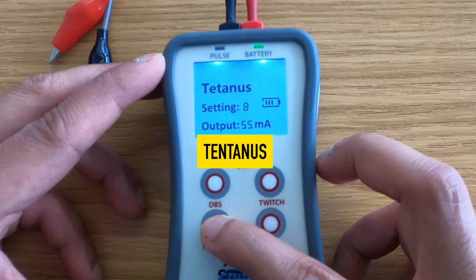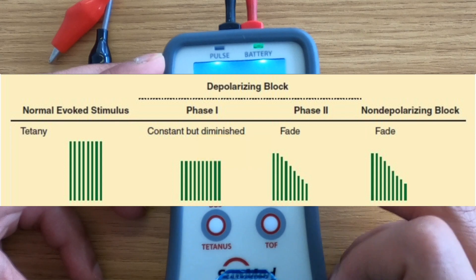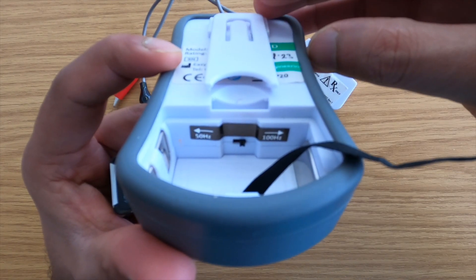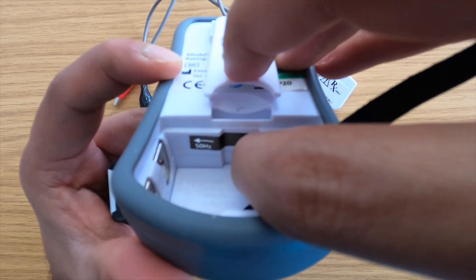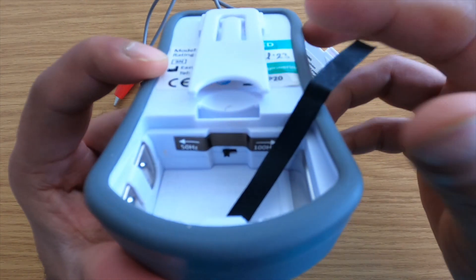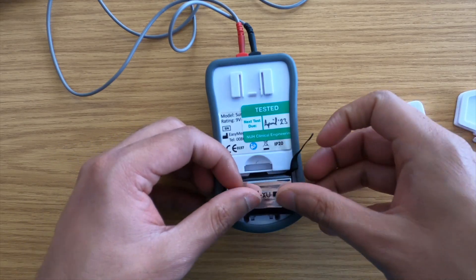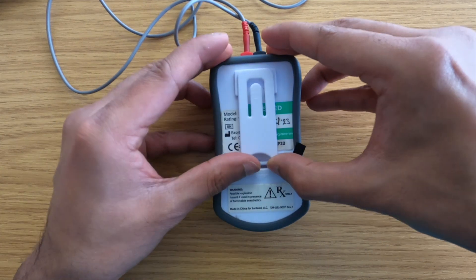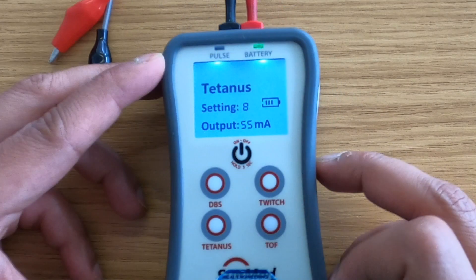Tetanus: this produces rapidly repeated stimuli when pressed and held down, provided the electrical stimuli is set at 100 Hz. This default can be changed to 50 Hz by opening up the battery cover and removing the battery. The slide switch is located within the battery compartment and can be used to set the desired frequency. Once this step is completed, reconnect the battery and close the battery cover prior to using the unit again. The tetanus stimulation should not be repeated more often than every two minutes due to post-tetanic facilitation.